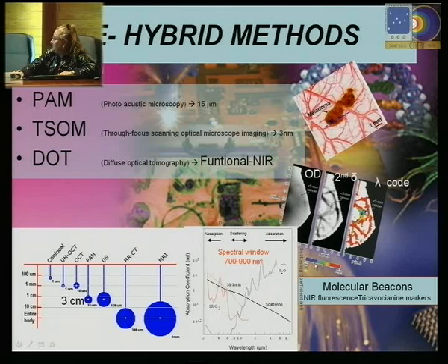When you code it, the 4 wavelengths, there are only 4 codes in here, 4 colors. If you code the 4 wavelengths, you get details which are not seen in normal even mammographies. And this is a cancer in this area of here of less than 5 millimeters of diameter.